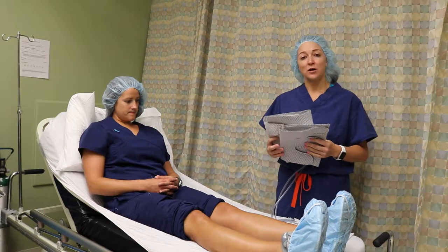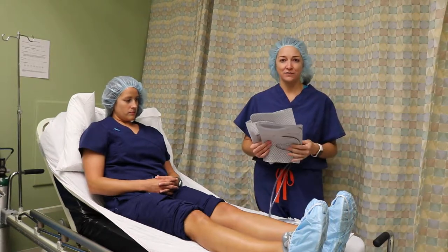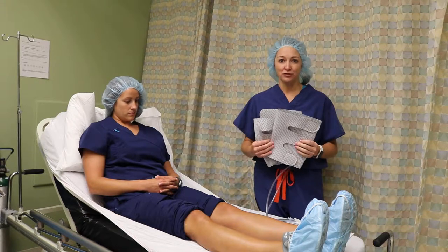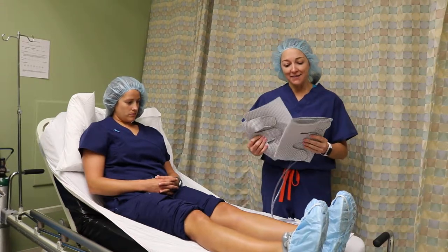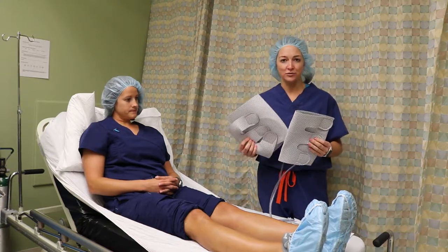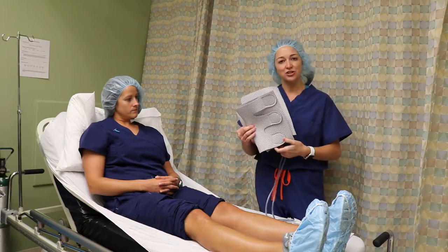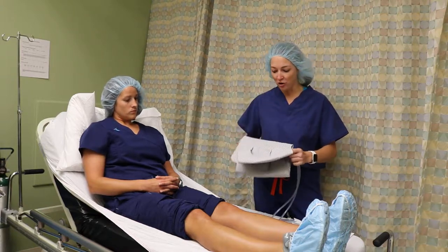However, there are some patients who do screen preoperatively very high as far as getting a blood clot after a surgery is performed. In that instance, we do send home patients with sequentials that they wear during the surgery. In that case, we're just going to show you how to put these sequentials on at home.